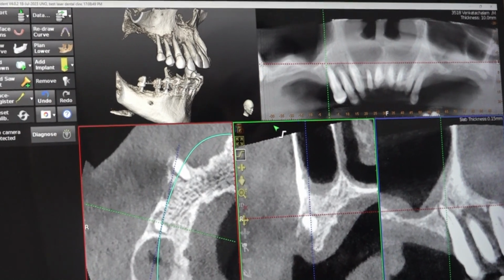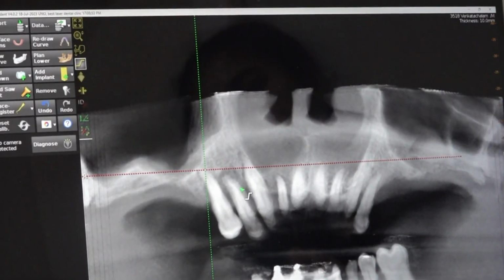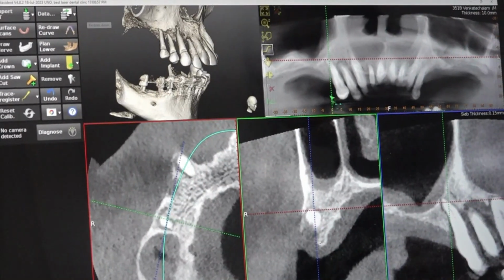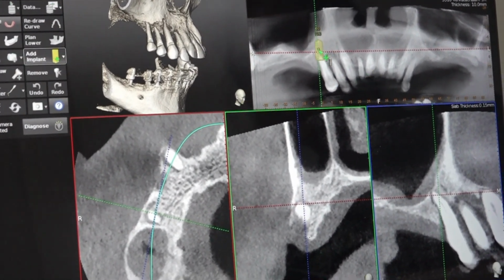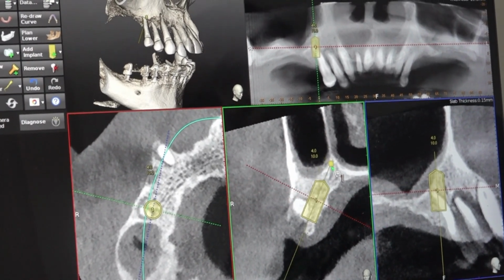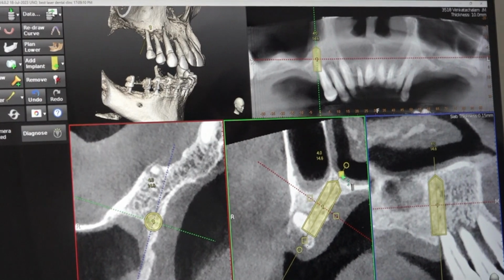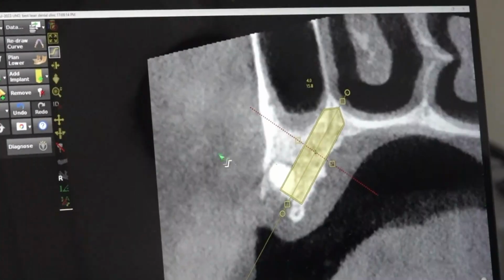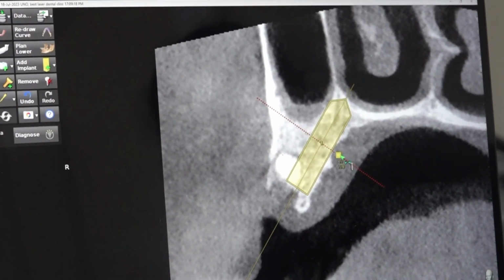Actually, we are planning for screw retained prosthesis. Okay, single piece multi-unit. So we will place one implant in there. This is the second premolar. Okay, just axial, tilting palatally. Okay, you can place here simpler than 4.1 by 15 or 3.75 by 15.